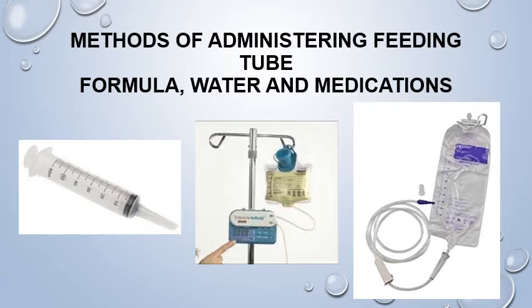The delegating licensed nurse will provide the DD personnel with specific tube feeding instructions. These instructions will include the type of supplement, the amount of each feeding, the number of feedings per day, the duration of each feeding or how long each feeding will last, the times of each feeding, and the tube flushes and amounts of water before, during, and after each feeding.